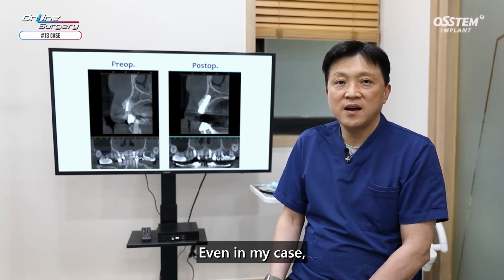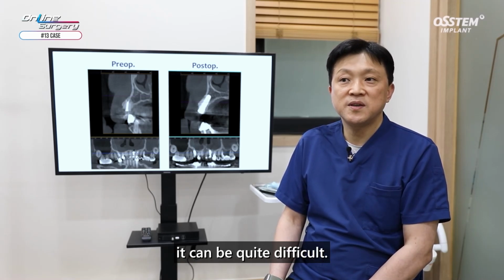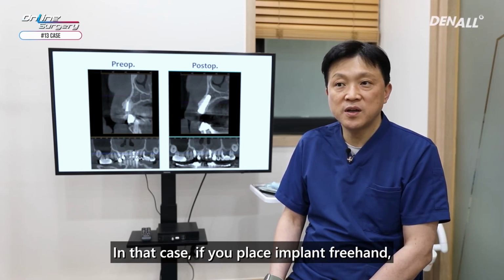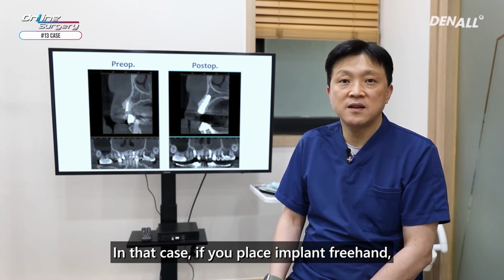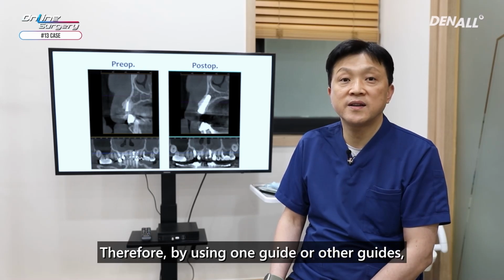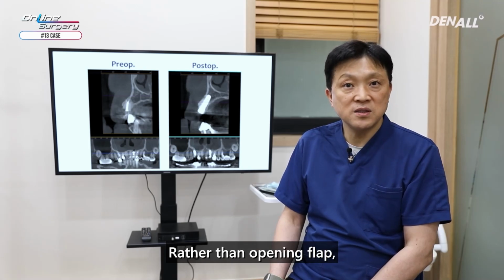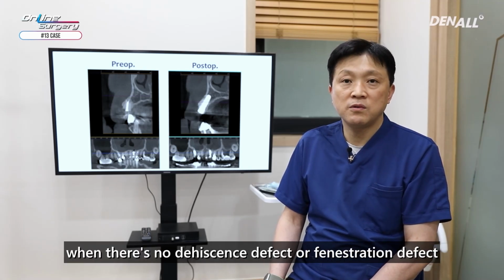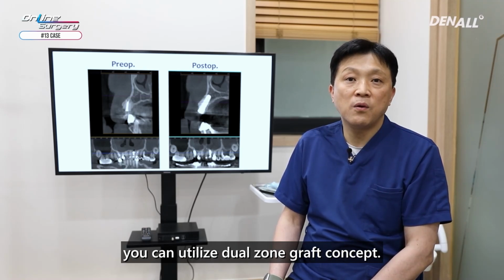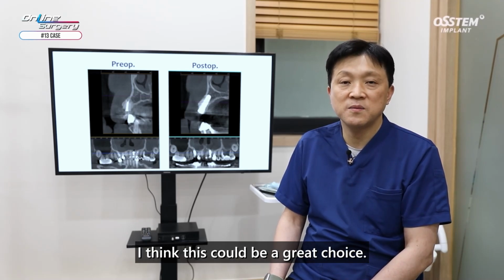Even in my case, when placing single implant in upper anterior, it can be quite difficult. In that case, if you place implant freehand, unintended errors can occur. Therefore, by using OneGuide or other guides, you can get better results. Rather than opening flap when there's no dehiscence defect or fenestration defect, as shown, without opening flap, you can utilize dual zone graft concept. I think this could be a great choice.